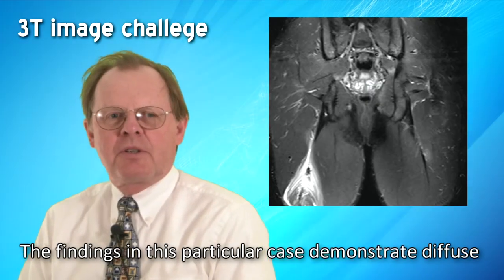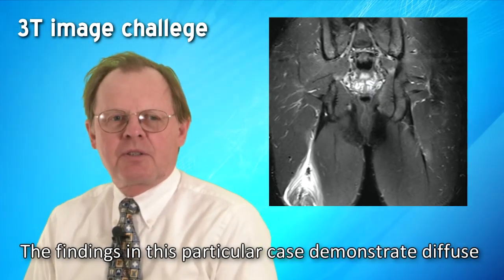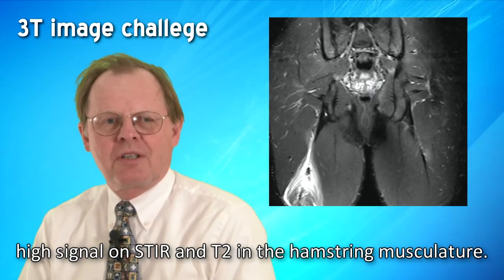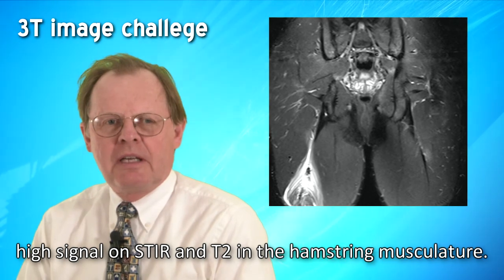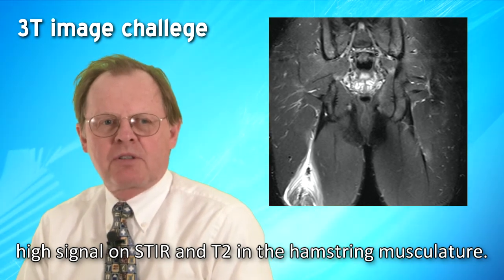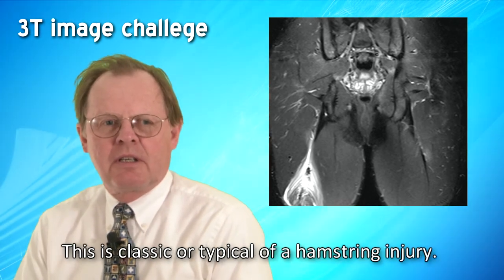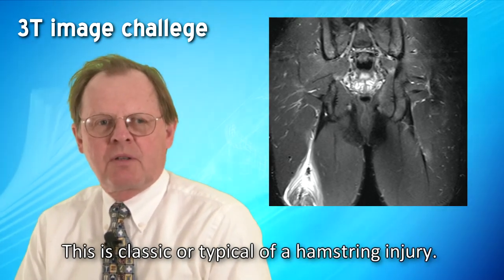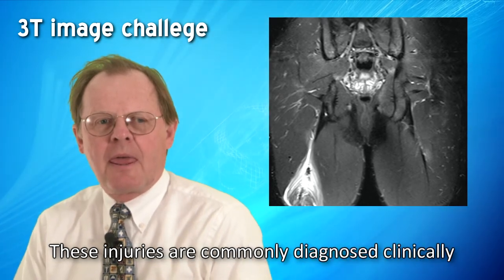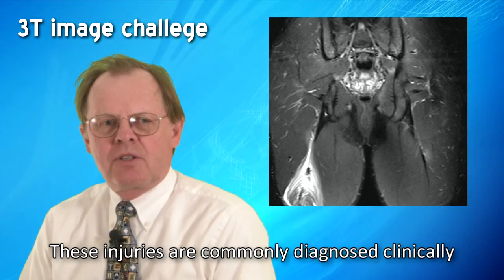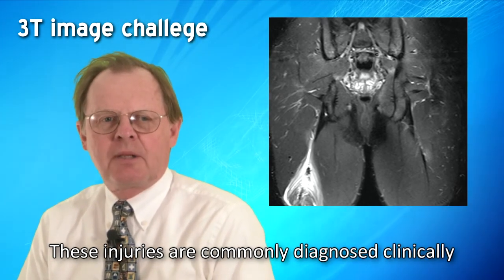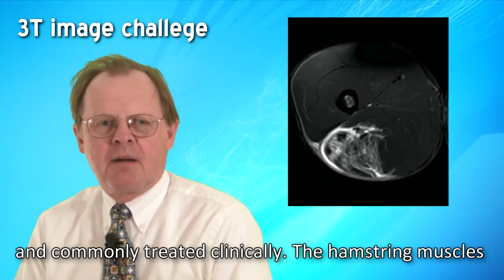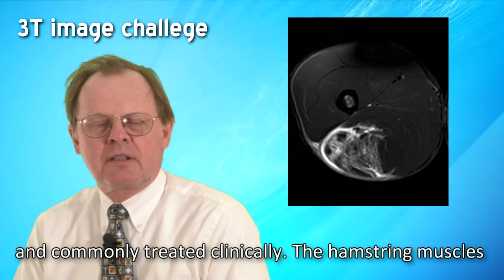The findings in this particular case demonstrate diffuse high signal on STIR and T2 in the hamstring musculature. This is classic or typical of a hamstring injury. These injuries are commonly diagnosed clinically and commonly treated clinically.